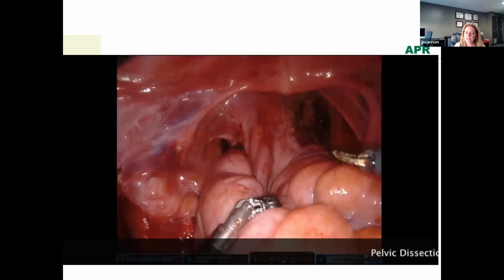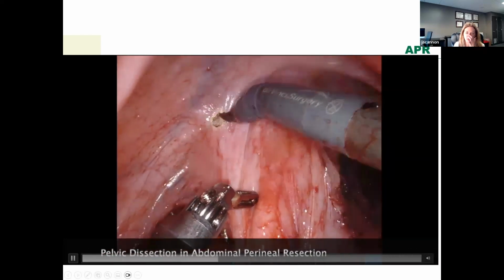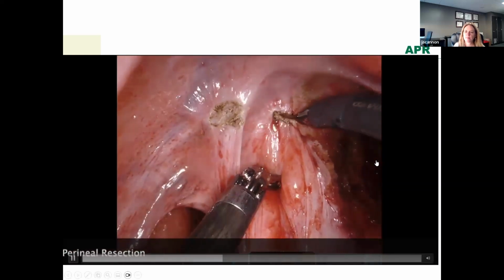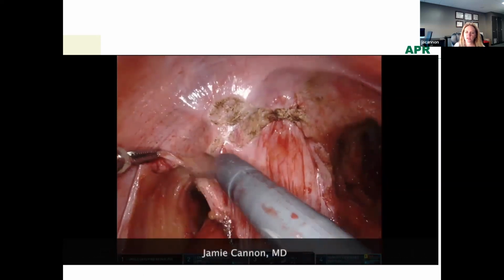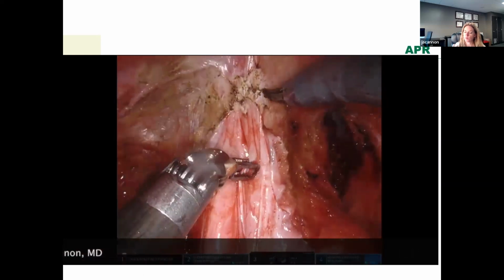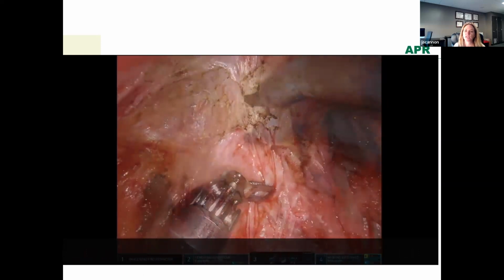When we're ready to divide the anterior peritoneal reflection, my grasping retractor is pulling the mobilized rectum out and directly back so that we can see where the true anterior peritoneal reflection is. We'll divide that peritoneum until we get down and are able to see a little bit of areolar tissue between the vagina and the rectum. Some patients will have some bulk of mesorectum in this area, while in other patients, the vagina and the mesorectum will be right on each other without really any fatty tissue.